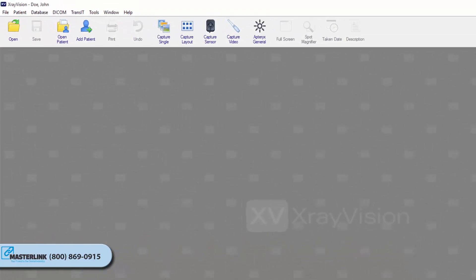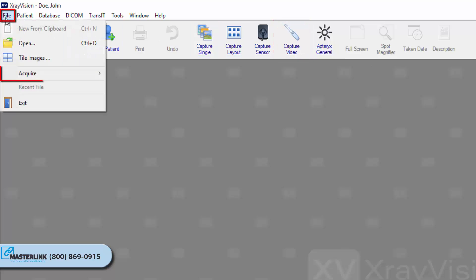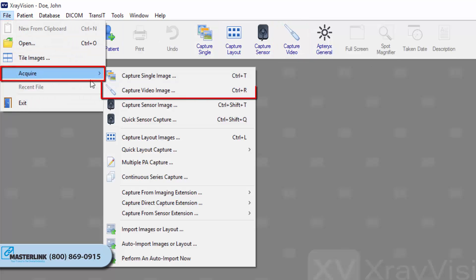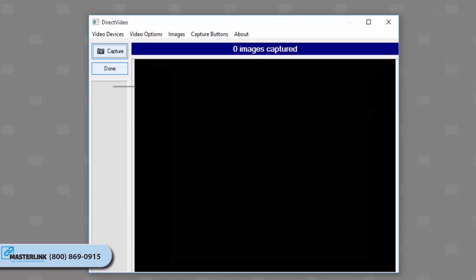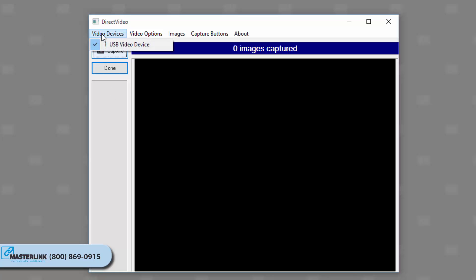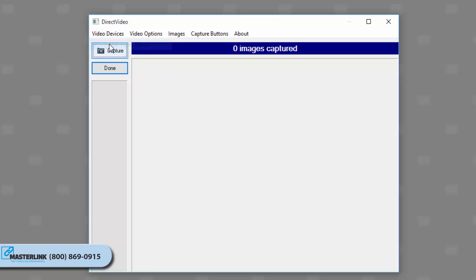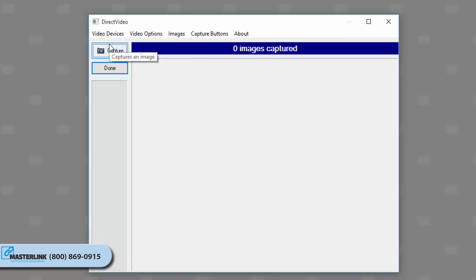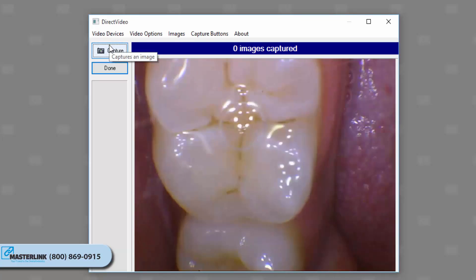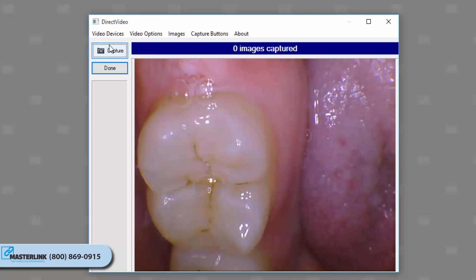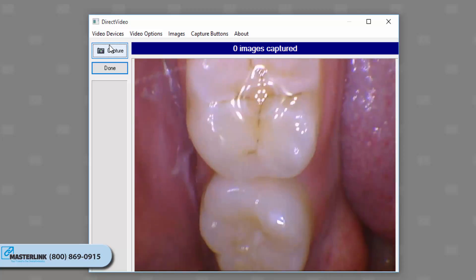Select the Capture Video Image button from the toolbar, or click File, Acquire, Capture Video Image. The direct video interface displays. Note: if more than one camera is attached to the computer, select Video Devices from the menu, and then select the correct device. Note that the live video feed is on the right-hand side. Place the camera in the patient's mouth and position it where desired.